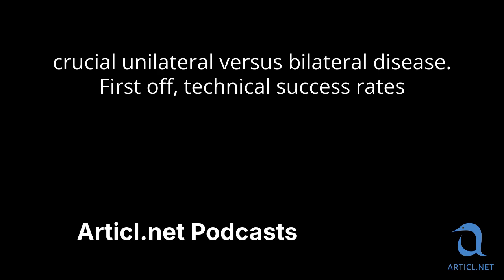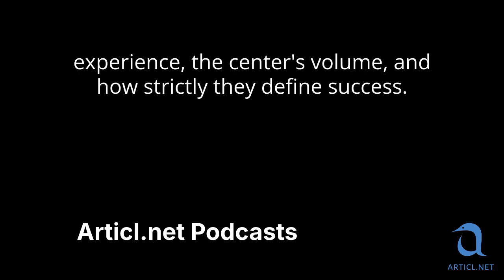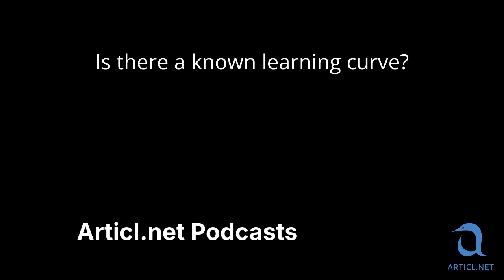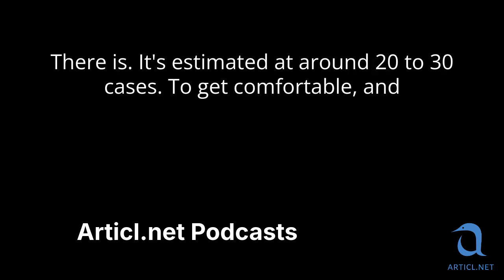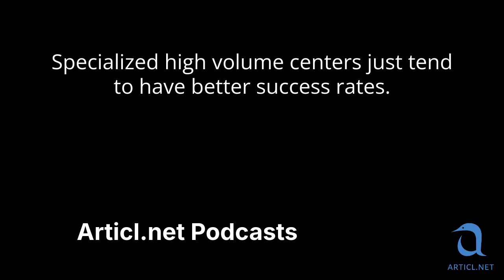First off, technical success rates themselves. They vary a lot in the literature. How much variation? Anywhere from, say, 40% up to nearly 100%. It really depends on the operator's experience, the center's volume, and how strictly they define success. Is there a known learning curve? There is. It's estimated at around 20 to 30 cases to get comfortable, and probably doing around 15 procedures a year is needed to maintain proficiency. Specialized, high-volume centers just tend to have better success rates.